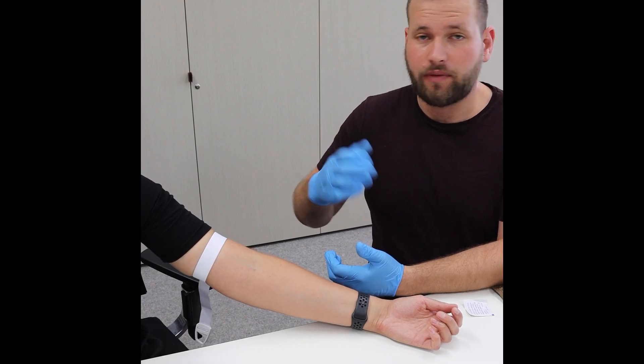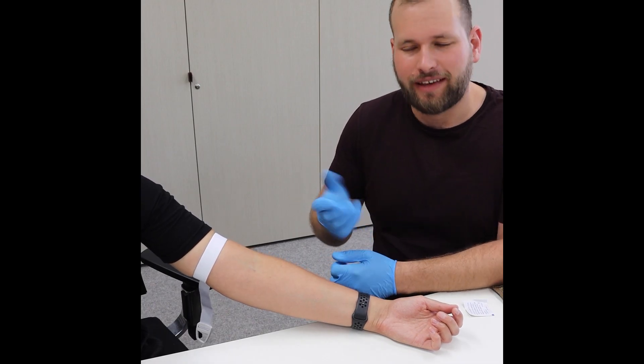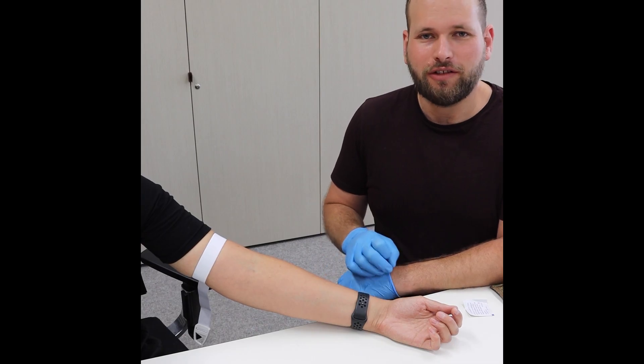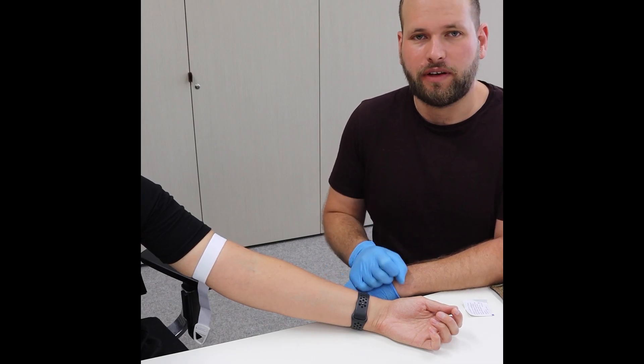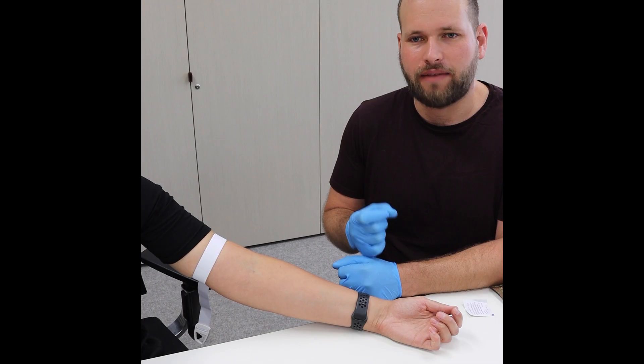So we all know those times everyone says, oh I've hit a valve and it's like, yeah, come on, you've just blown it, let's be honest. But sometimes you may have hit a valve and this is a little trick on how to save that cannula.